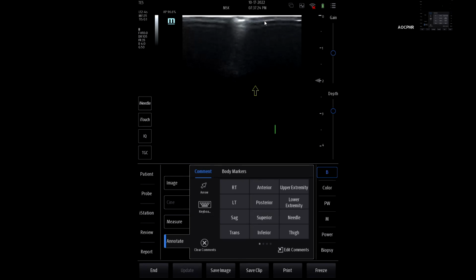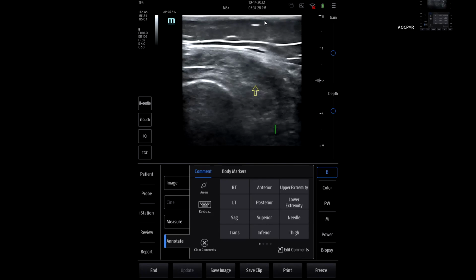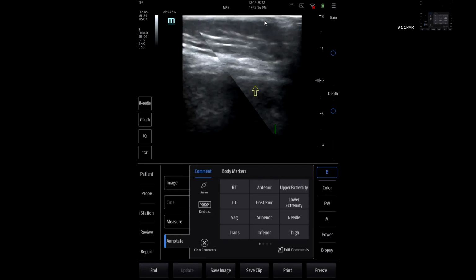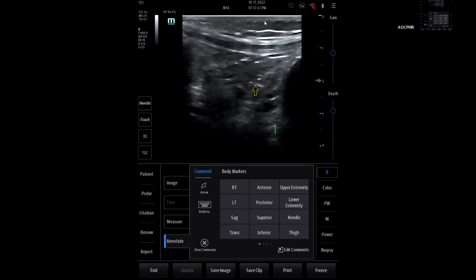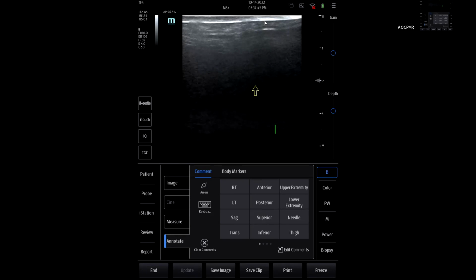All right. If you want to look at the IT band, it's going to be a little tough to see with where your pants are. We'll skip that one. Everybody can find your IT band. It's not hard to find. All right, let's quickly move on.